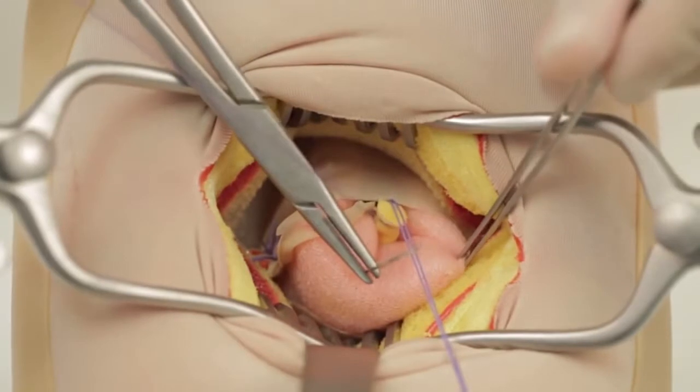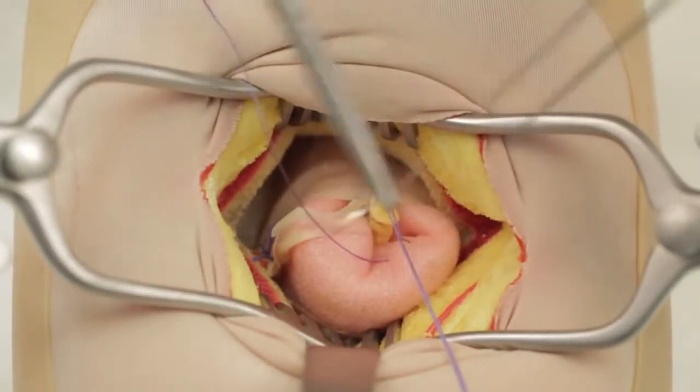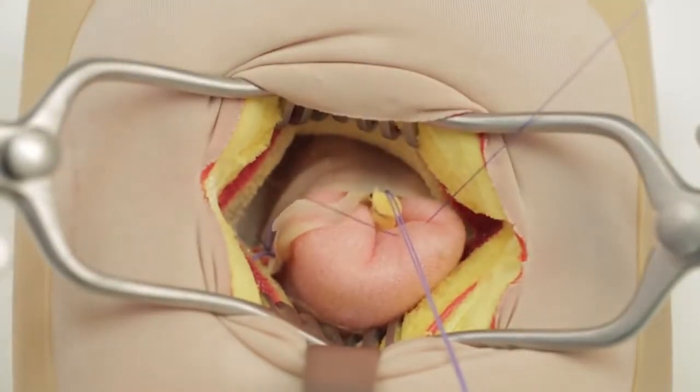Insert a seromuscular purse string suture of 2-0 PDS or similar material on a round-bodied needle encircling the appendix base.